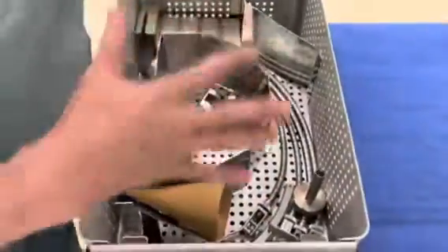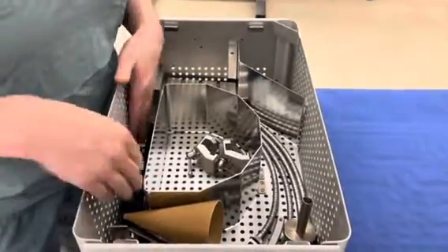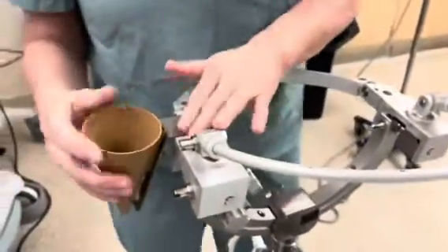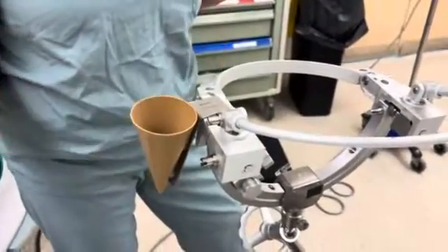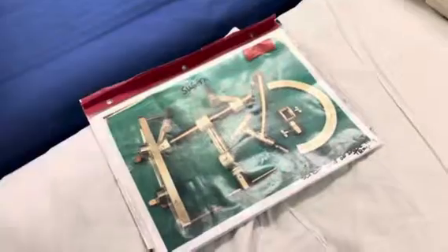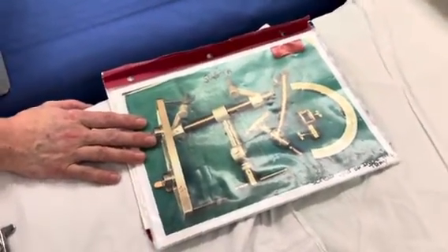There are accessories in here — different blades that they can use, though you don't really need to know how to put those together. There's even a little cone that you can put right in here, and the surgeon could place their bipolar cautery in there. Right now there is a reference book covering the Mayfields and the Sugita, but I'm going to update that. And that's it.